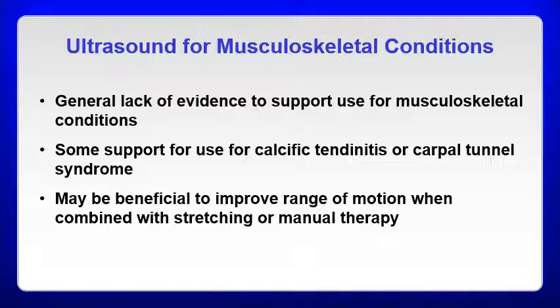Again, I'll bring this up again with ultrasound later. From a technique perspective, ultrasound many times is not done properly. So one of the things I really want you to take away is that this is a modality that can be effective, but part of it is, one, having your treatment parameters, and two, your technique with the treatment being good so that the patient gets the most out of it.